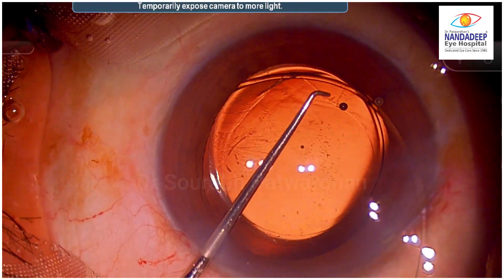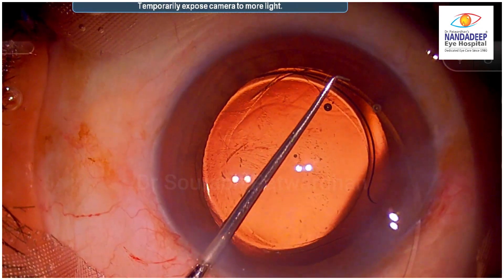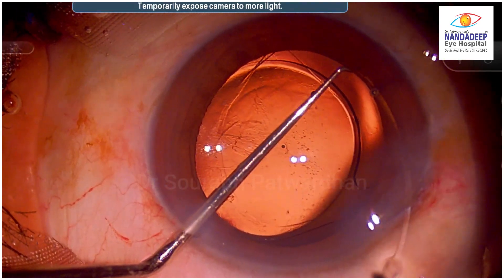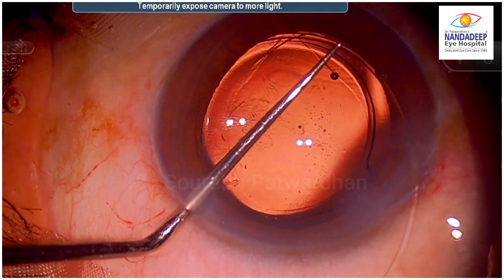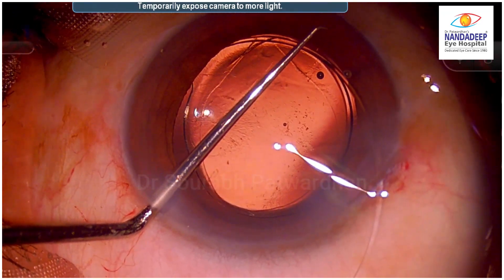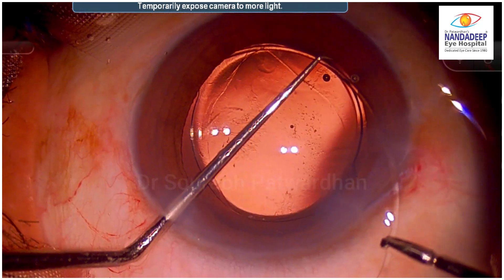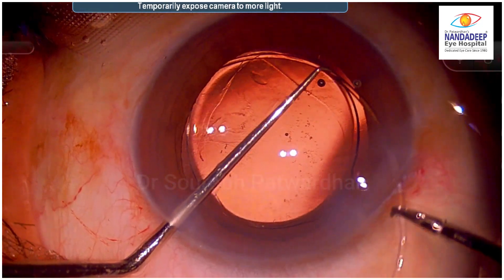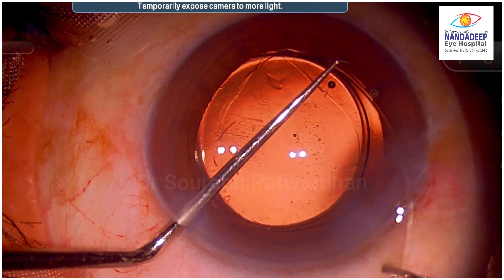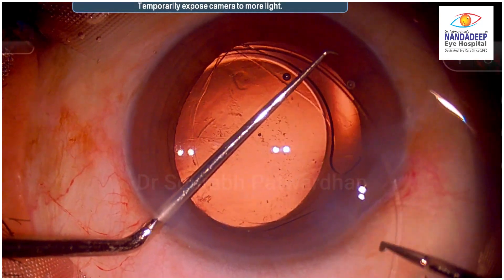The surgeon is using the Sinski dialer in the left hand to guide the CTR, but unfortunately the surgeon is not pushing it properly down into the bag — just lying over the CTR but not actually nudging the CTR into the bag, and that's a mistake. As you can see, the surgeon tries to push the CTR further but it is not going into the bag. With the resistance from the capsule, this springy CTR now tries to come out of the bag.